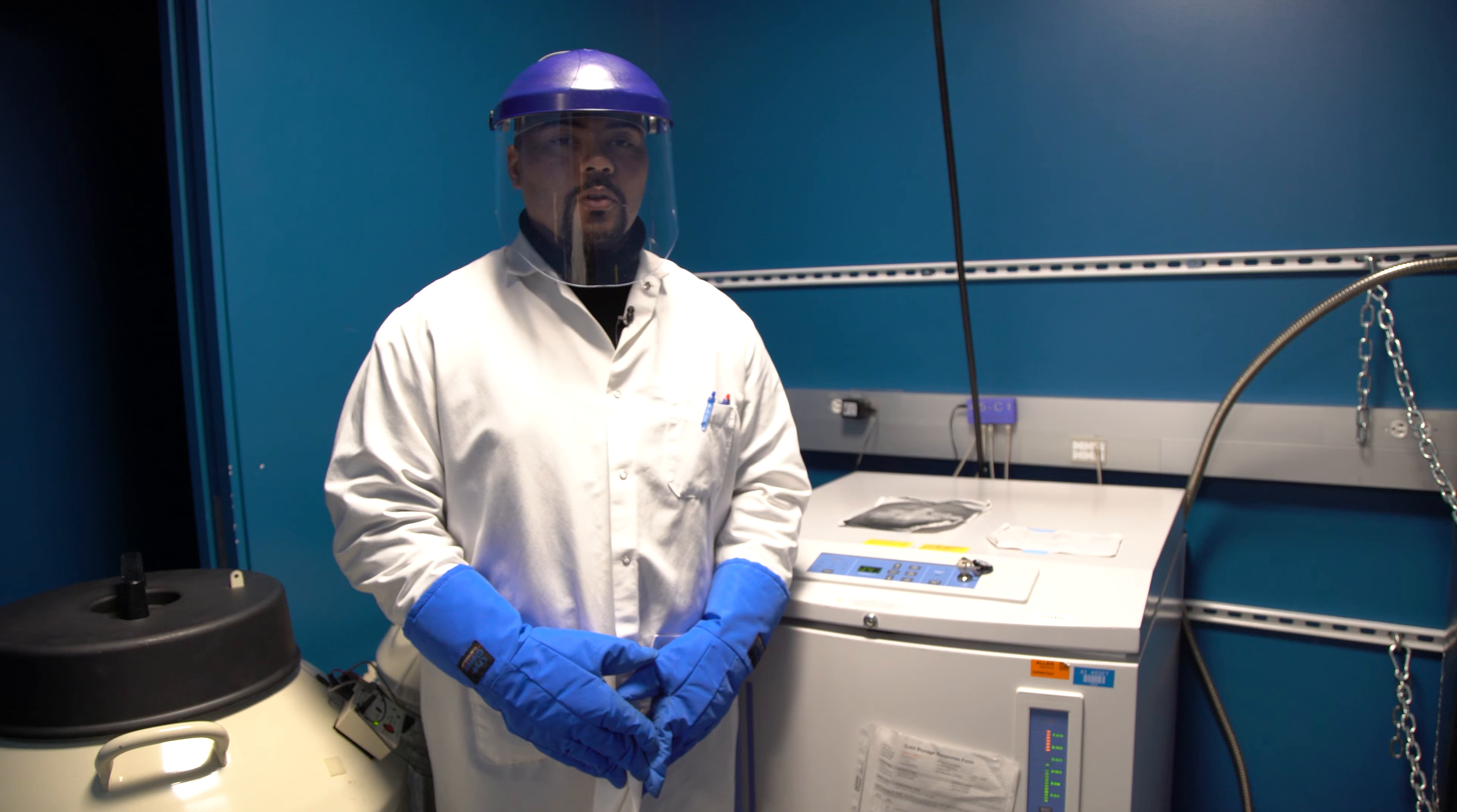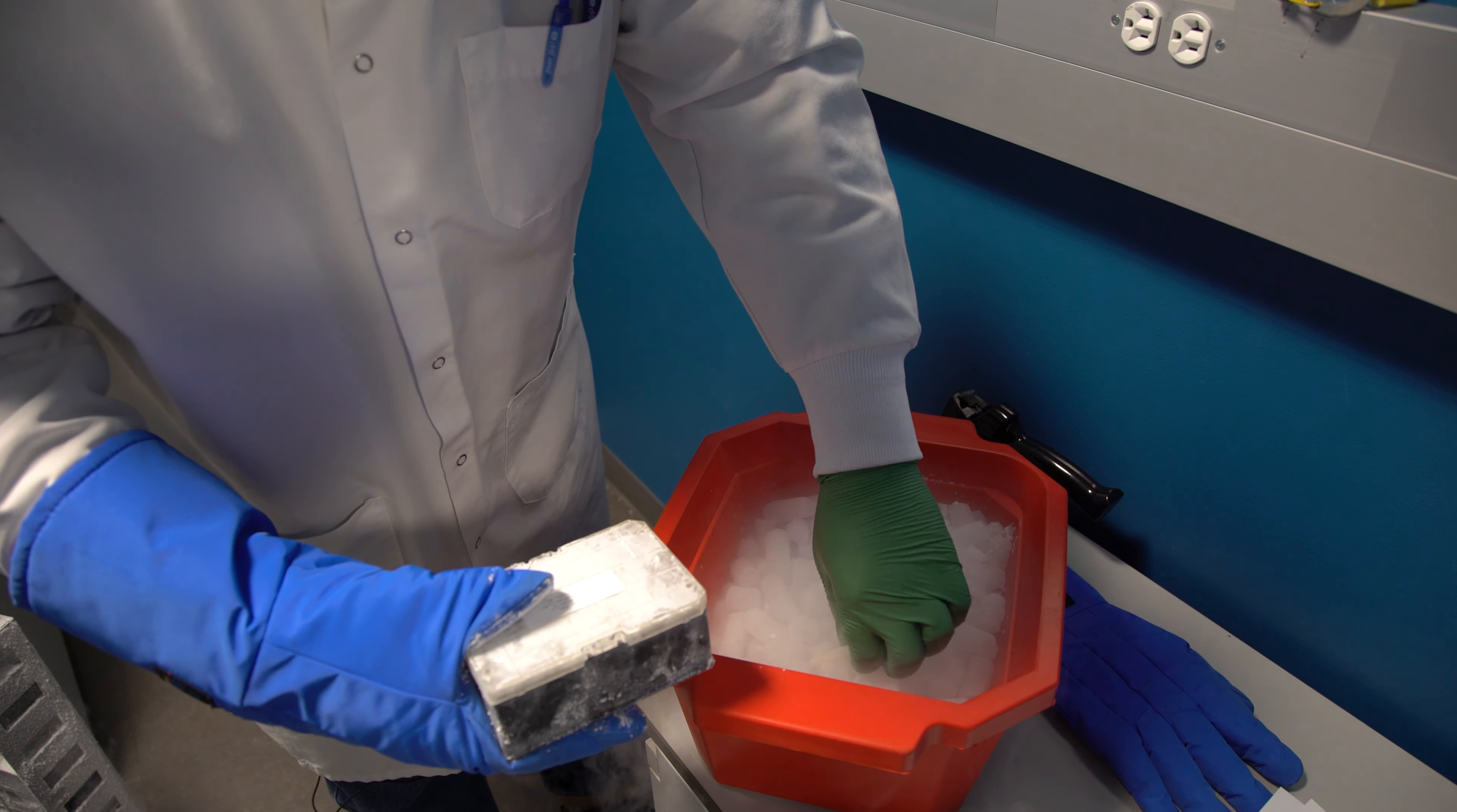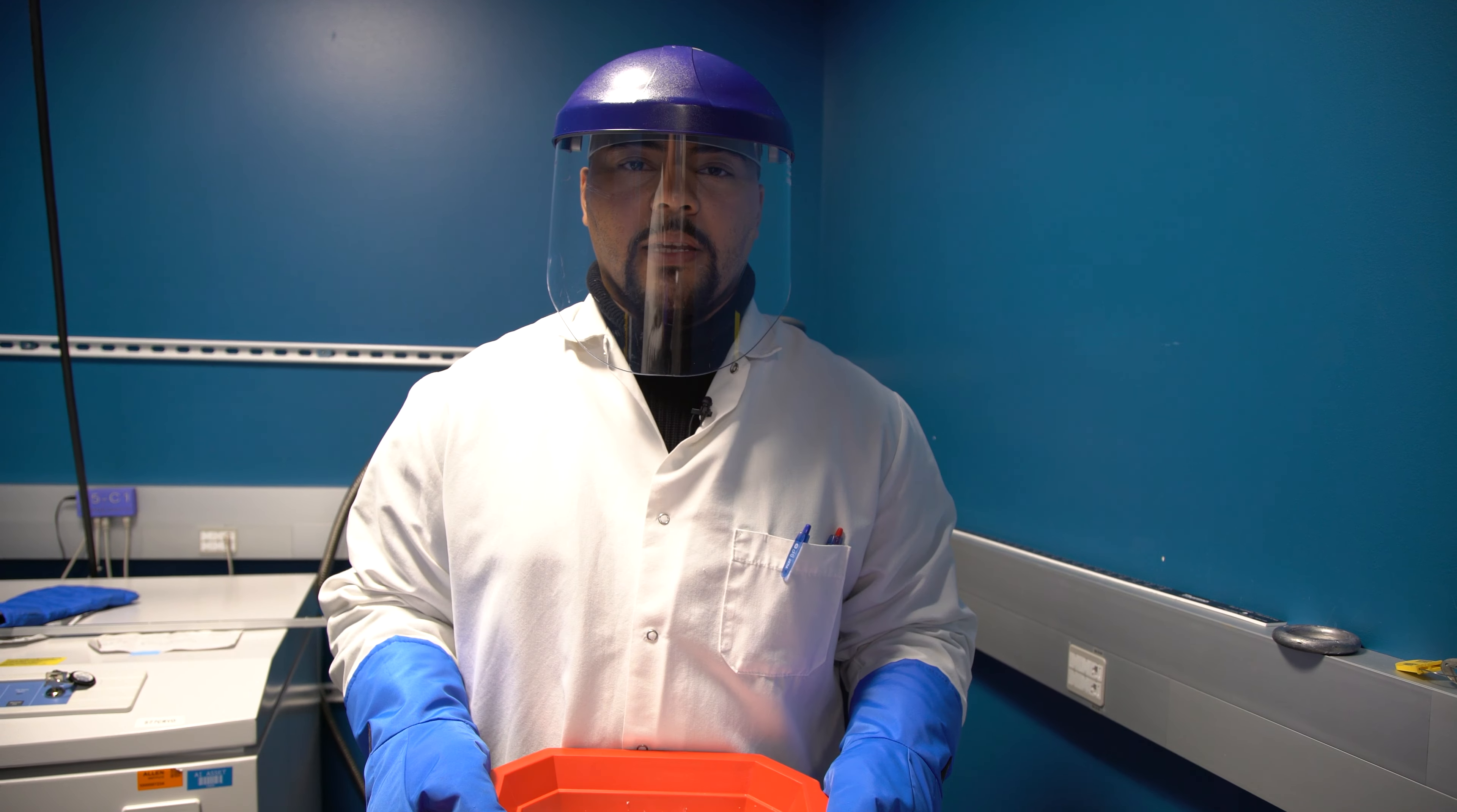In addition to that, we also will need a bucket of dry ice to contain our cells as we transfer them to the lab. Now I'm going to go in and grab our vials. Now that we've moved our vial from the vapor phase dewar into dry ice, we can move these cells into the lab to begin thawing.